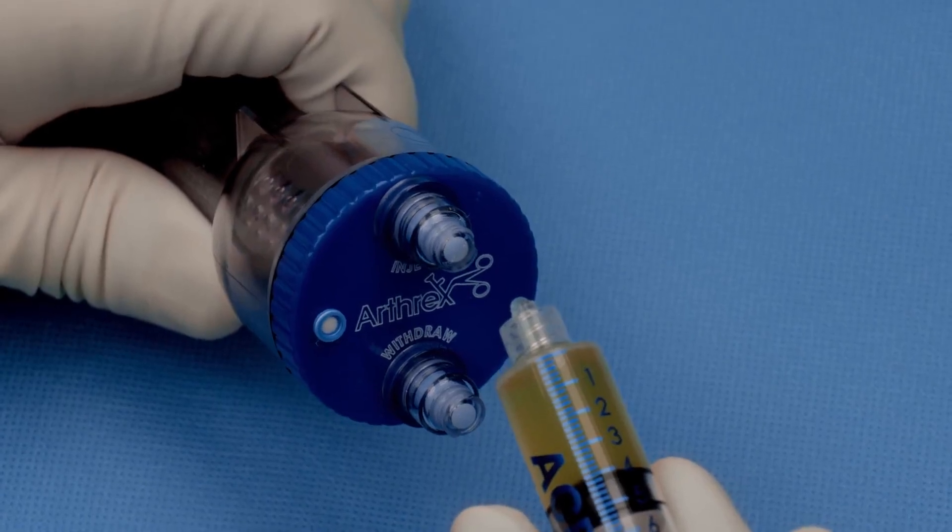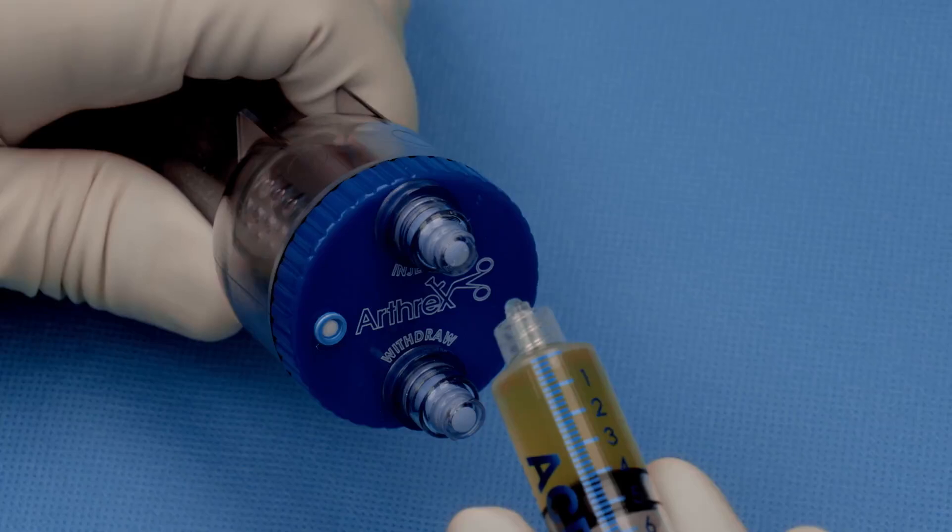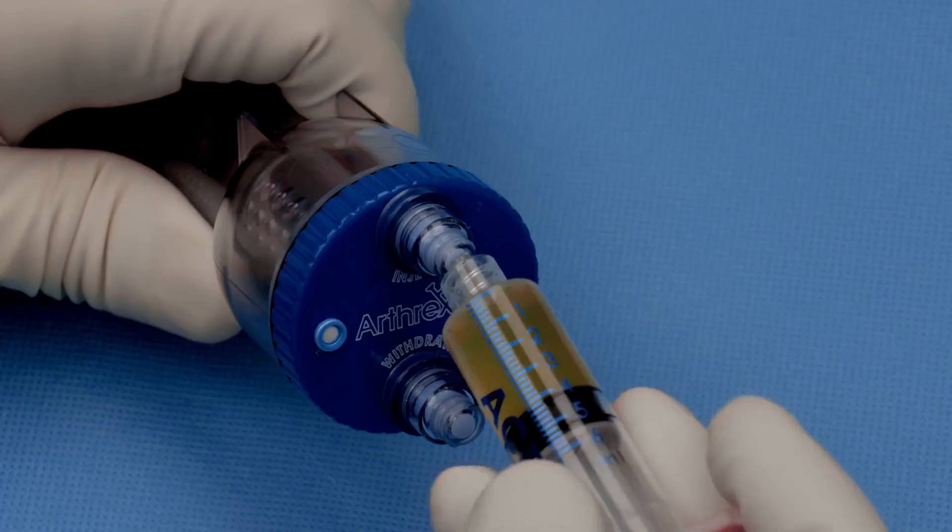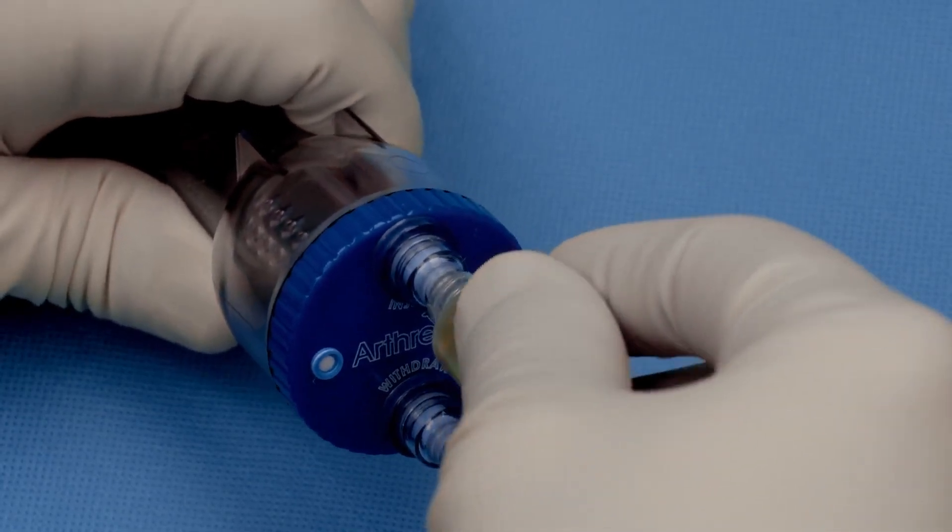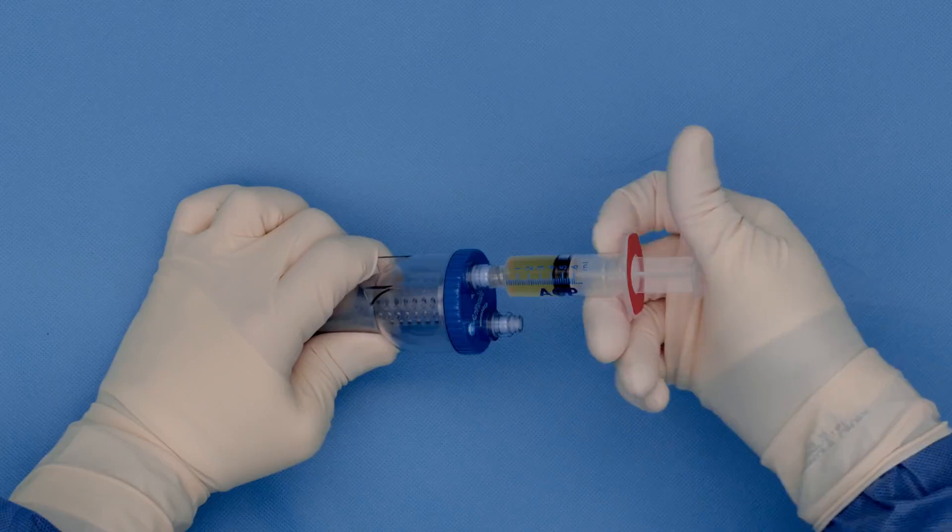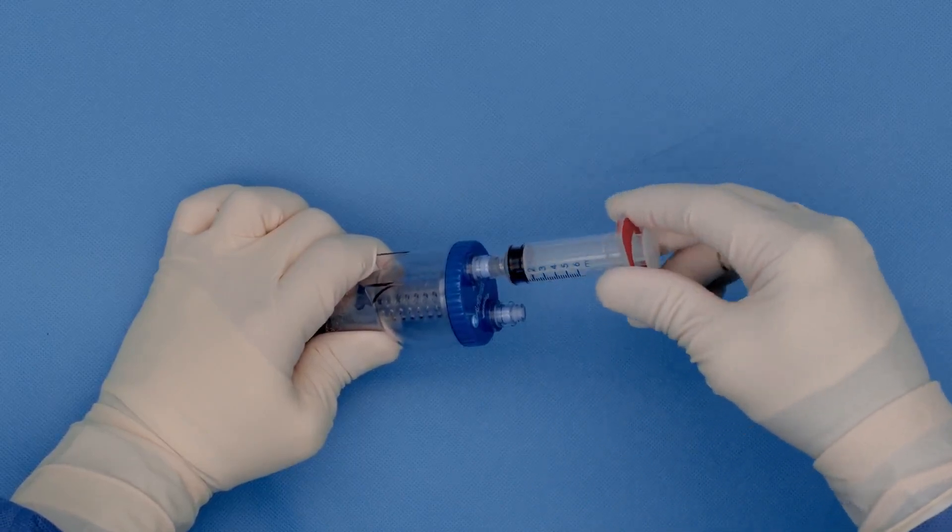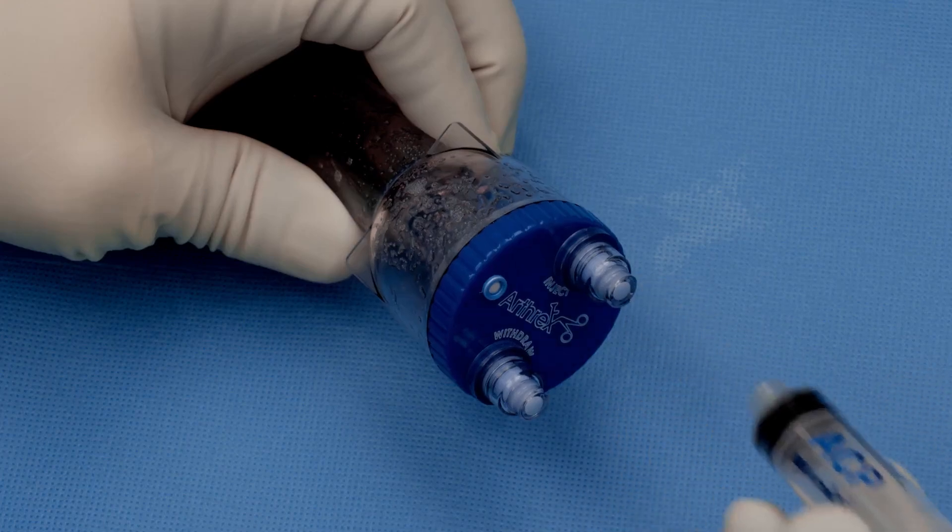During our first step of thrombin production, we are connecting our ACP syringe to the injection site of the thrombinator. And then we are directly applying 4 ml of the ACP into the thrombinator. Then you take away the ACP syringe.